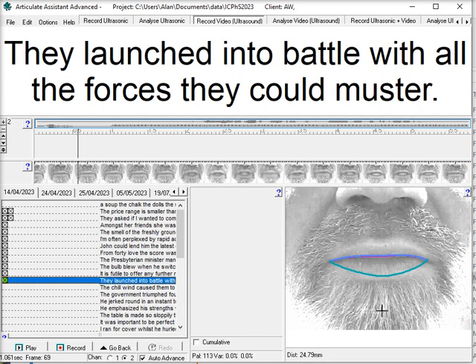Now this is incorrect. So what we need to do is rescale these splines so that they reflect the real world distance. So there's two ways of doing this. One, you can either place a ruler in one of the recordings next to the lips to show the actual millimeter distance, or you can take a measurement off the participant themselves from, in this case, the tip of the nose to the chin. And in this case we will do that. So we've made that measure and it's 70 millimeters.